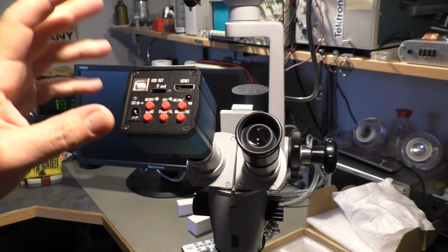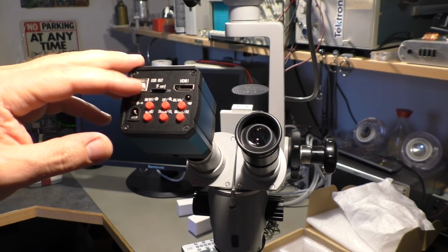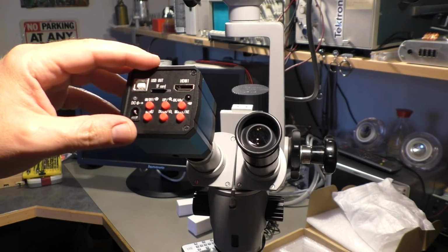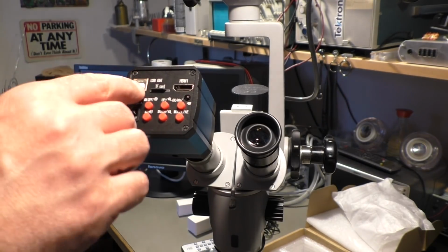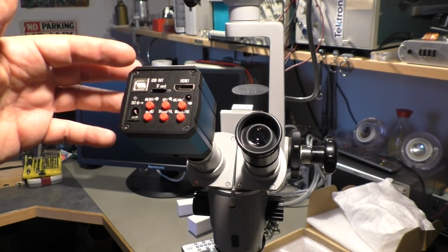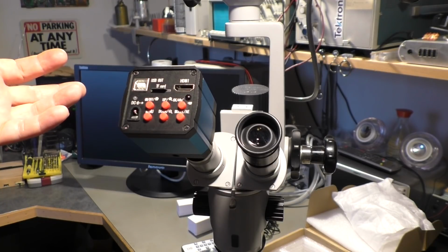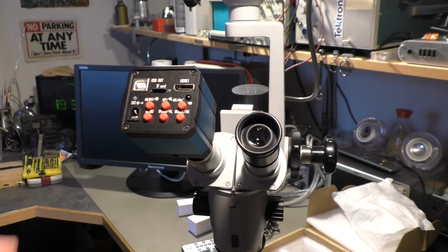And as I already said, you have USB and HDMI. You can use the USB to transmit pictures to your PC or whatever you have, but I had a little bit of trouble with that. I don't know if it's a problem with my Mac and VLC player, but I got about 5 seconds of image, then I got a frozen image for another 5 seconds, and then again 5 seconds of image, frozen 5 seconds, and so on.